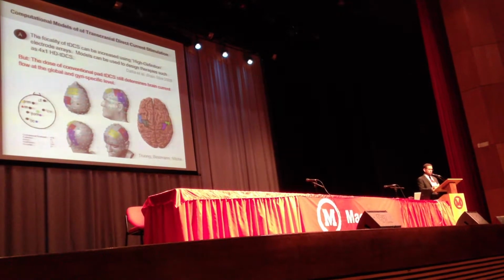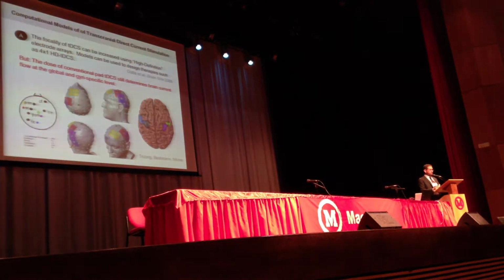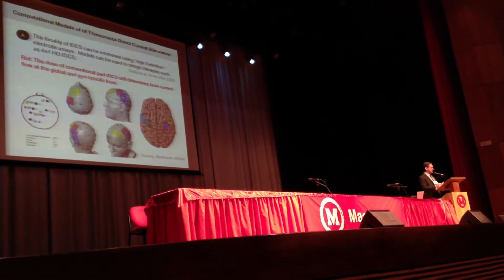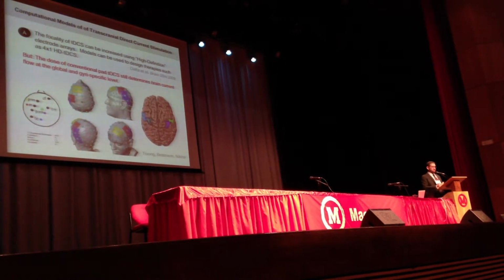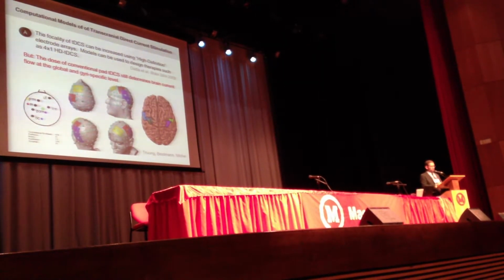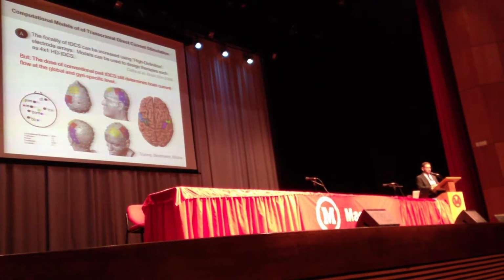be used in a way that's dose-specific. Certainly by manipulating the position of the pads, by changing their size, you could have very specific effects, not just on the global level, but at a gyri-specific level as well. One study that we're working on now with Dr.